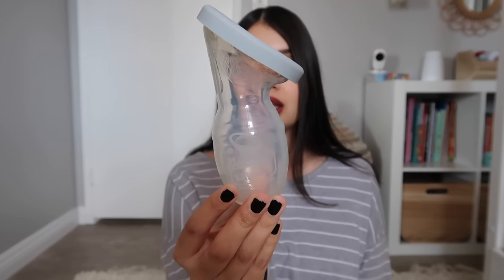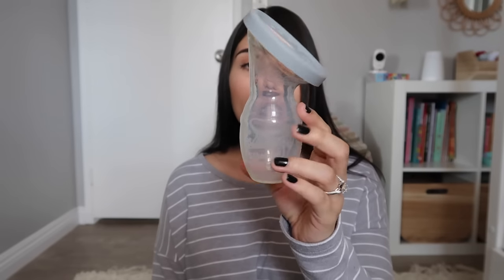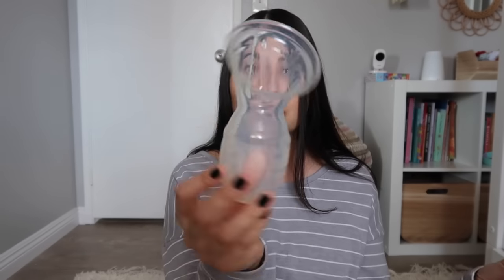I actually do have a hack for you guys that I'll share later in this video if you have the older version like mine that does not have the suction bottom. Again, it is very soft, it's not going to hurt you at all. It's really nice because it is lightweight, it doesn't have to be plugged into the wall, there's no wiring or anything. This is literally it — you don't need any extra parts to catch your letdown.